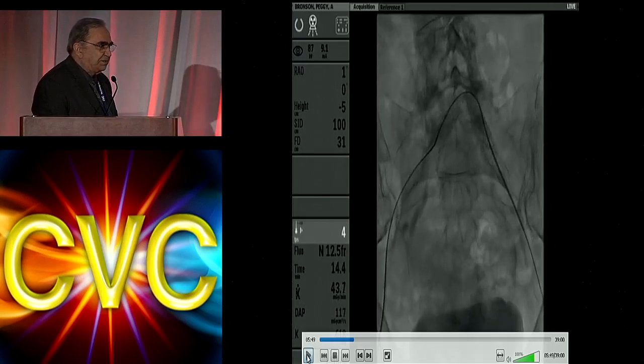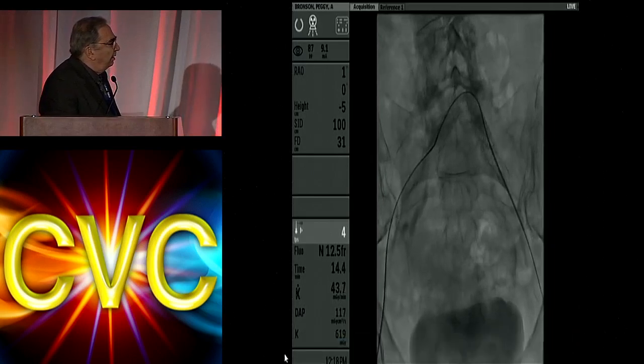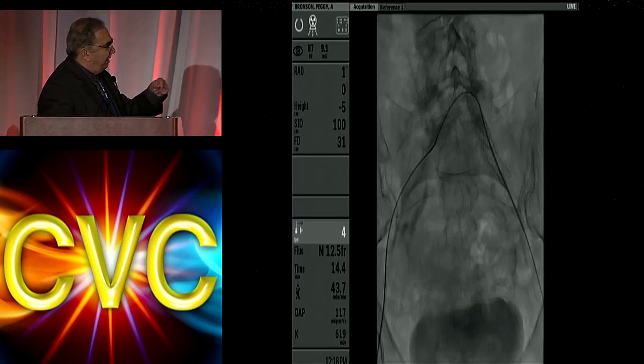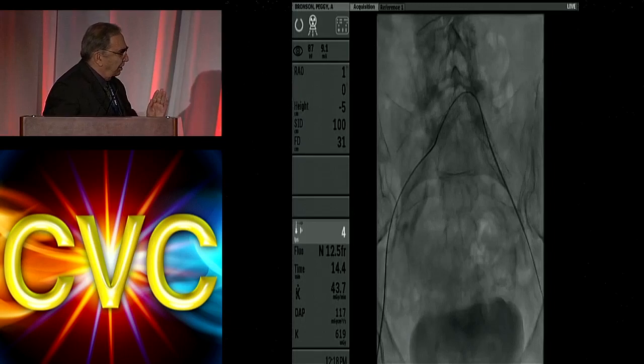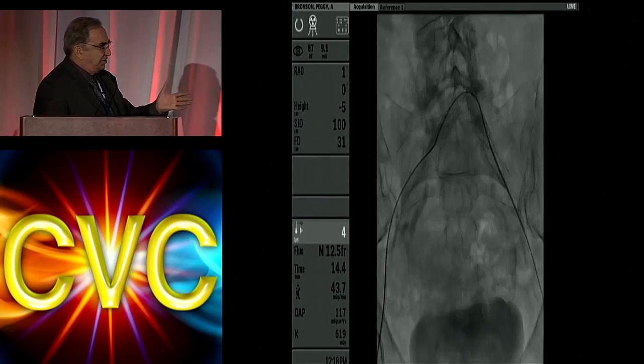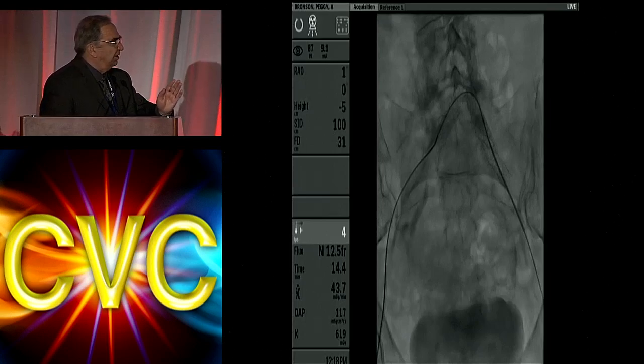Hold the tape, please. Amir, you think you're in the stent strut on the right rather than the lumen? Yes, as I'm getting in, you see the chink right now? I think the problem is right there. It's really calcified, so that's probably what we'll do: use either Turbohawk or Diamondback. We'll have to see. Because this is a bare stent, and I went from the side of it, there is a chink in the artery right there. We'll check pressures later.